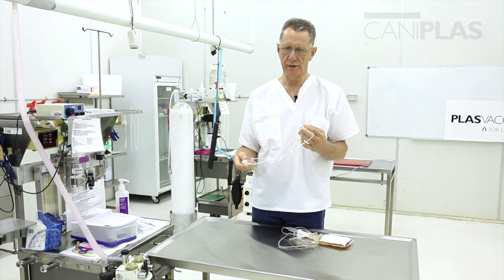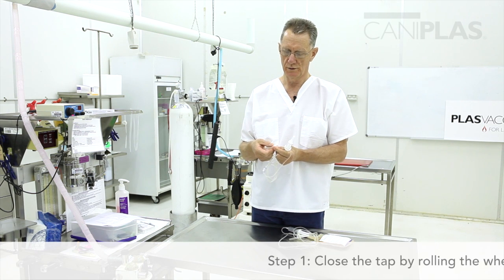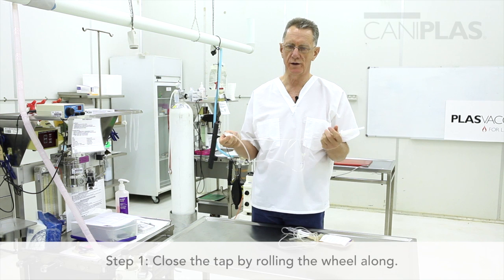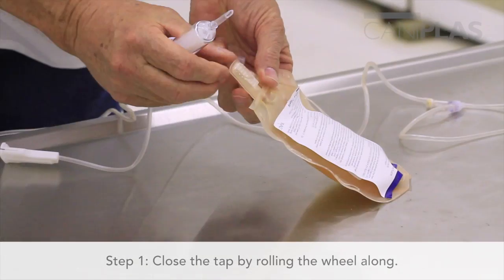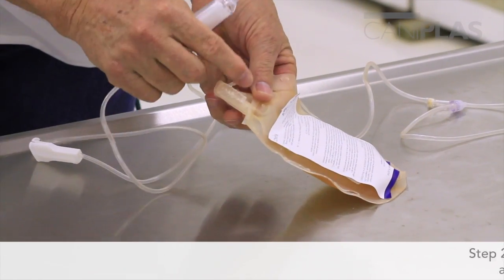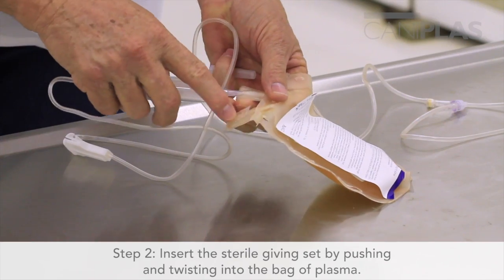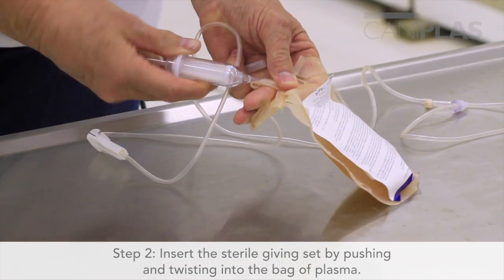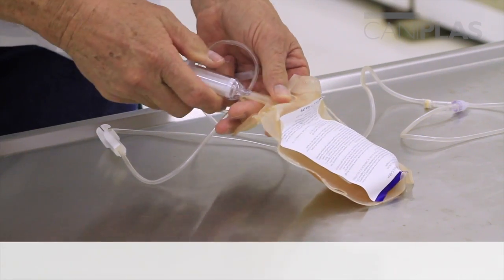The first thing we need to do is close the tap by rolling the wheel along, so that plasma doesn't run all over the floor after you spike the bag. This is a sterile giving set. I insert it and twist as I push — that's to stop you piercing the side of the bag and allowing the plasma to leak.